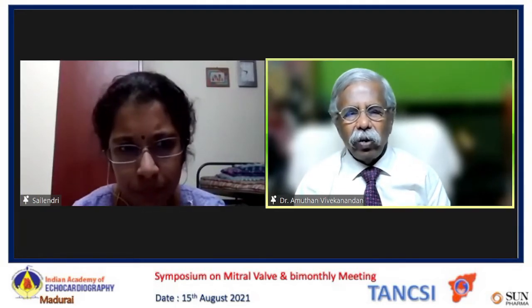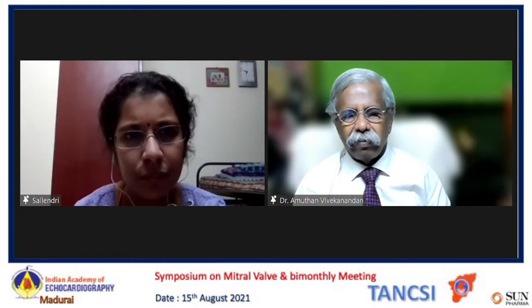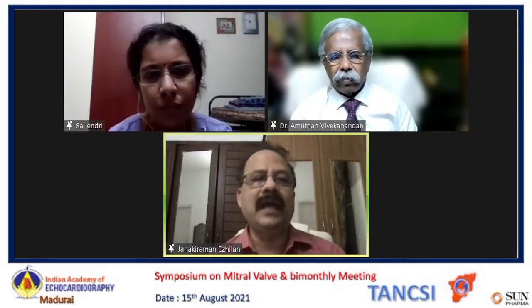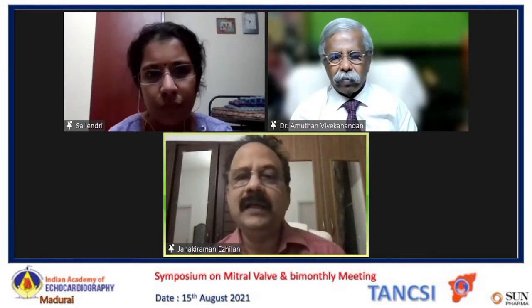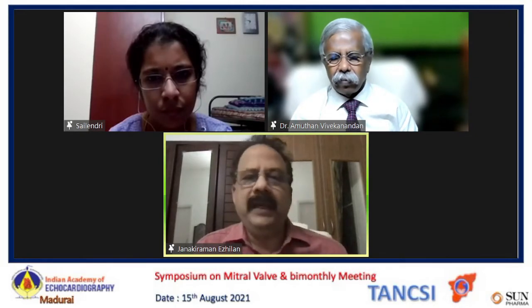Leland, sir, you want to take it? Yes, sir. We just wanted to show this interesting case because, as cardiologists, seeing the vegetation and the abscess, we would jump in and treat it as infective endocarditis. But here, PET CT helped us show that it was all healed vegetation and probably a healed abscess, which remained as such even after the treatment. The patient recovered from the pneumonia, and now we are planning to send him for an aortic valve replacement.